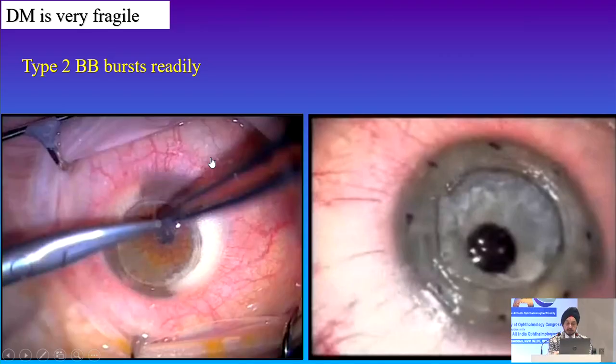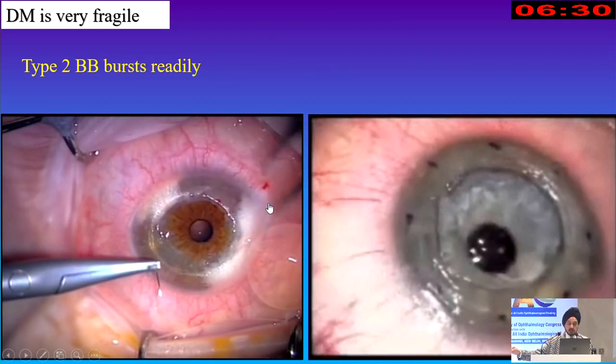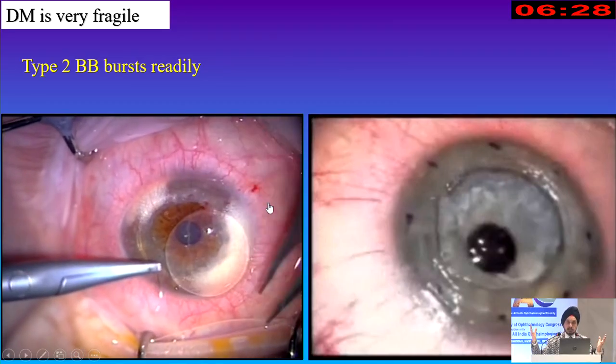And this is what happens if you're not aware, and this has happened when we were not aware of this kind of bubble. Now, the first one is from Kana Ramesh, who kindly loaned me this video, and you can see what's happening here is that the cornea has been put, he moves the eye to one side, and just that pressure allows the Descemet's to burst.